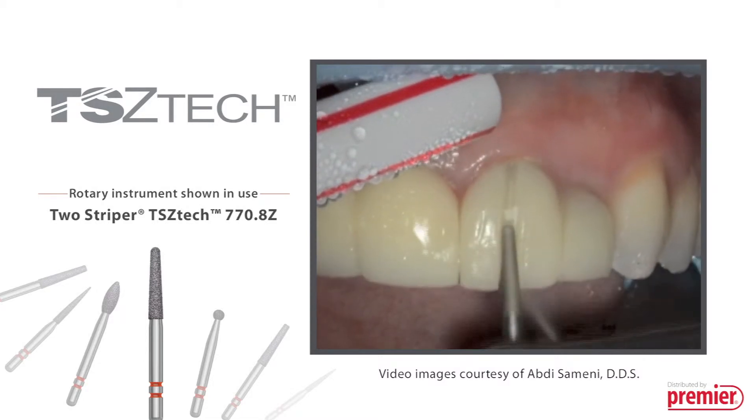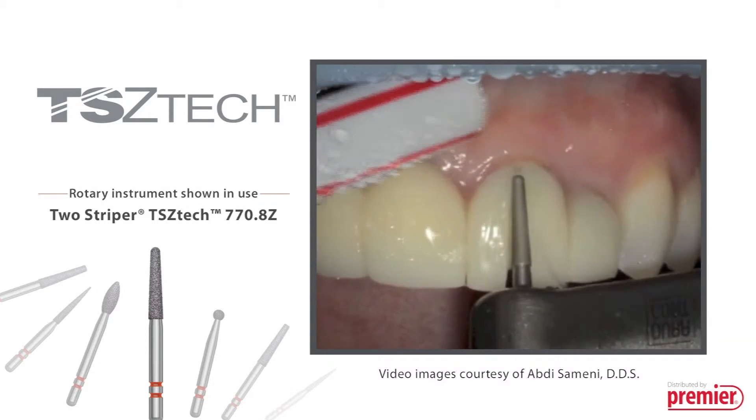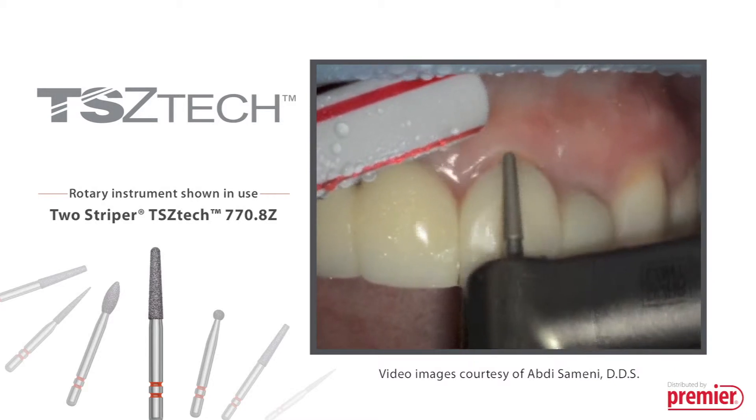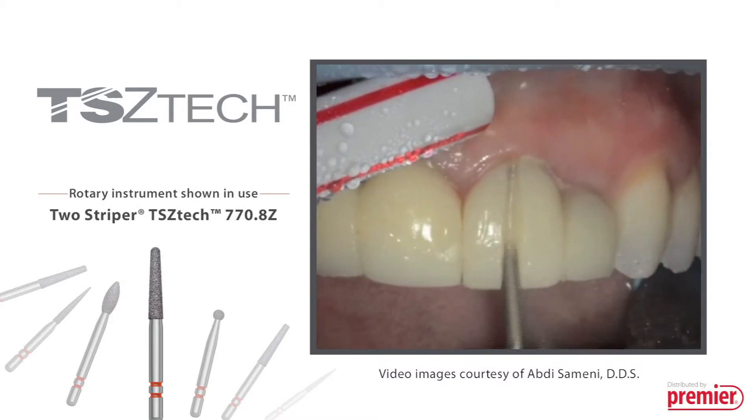You are watching the 770.8 Z Diamond in action as it efficiently cuts through two crowns. TS Zetac Diamonds provide faster and cooler cutting with less trauma and no sparking.